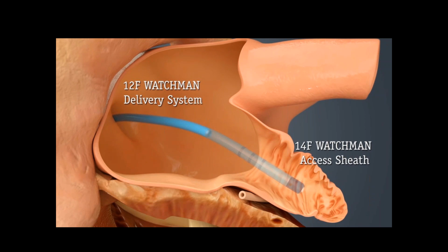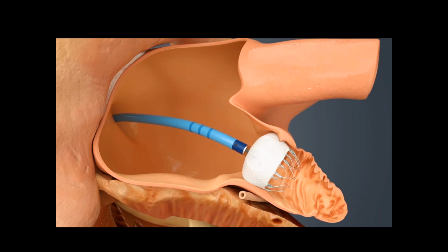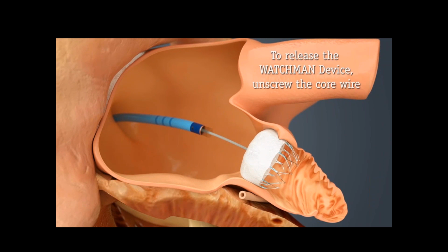The device is pulled back. The nitinol springs open, and we seat our device there. There's little hooks here, and there's compression. We oversize the device so it's bigger, and it's held into place. We test it by pulling on it, and we pull pretty vigorously. We make sure that there's a good seal here. We look under ultrasound to make sure we like it. We release it, and it's securely seated in the appendage.